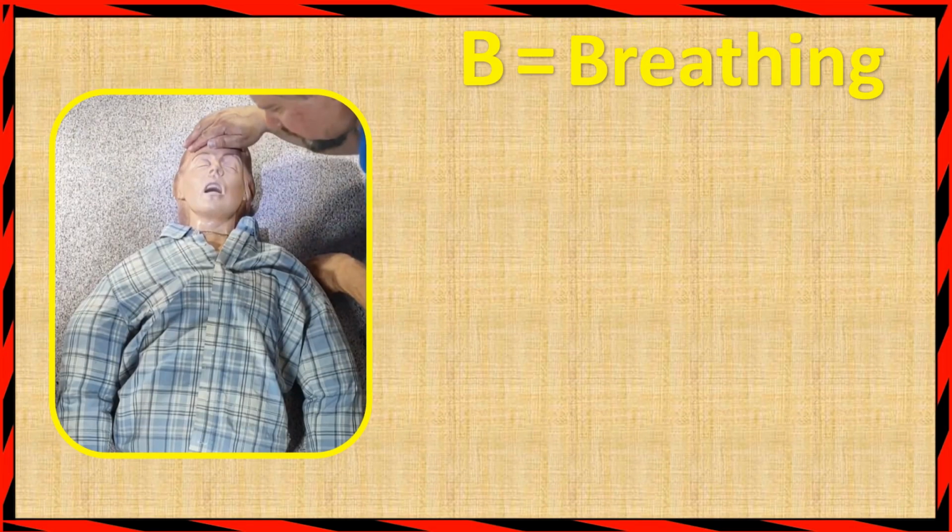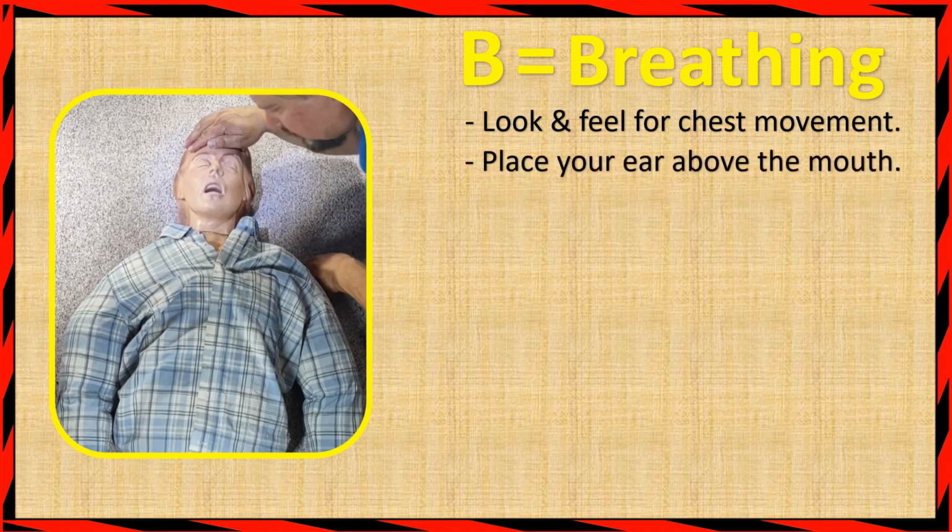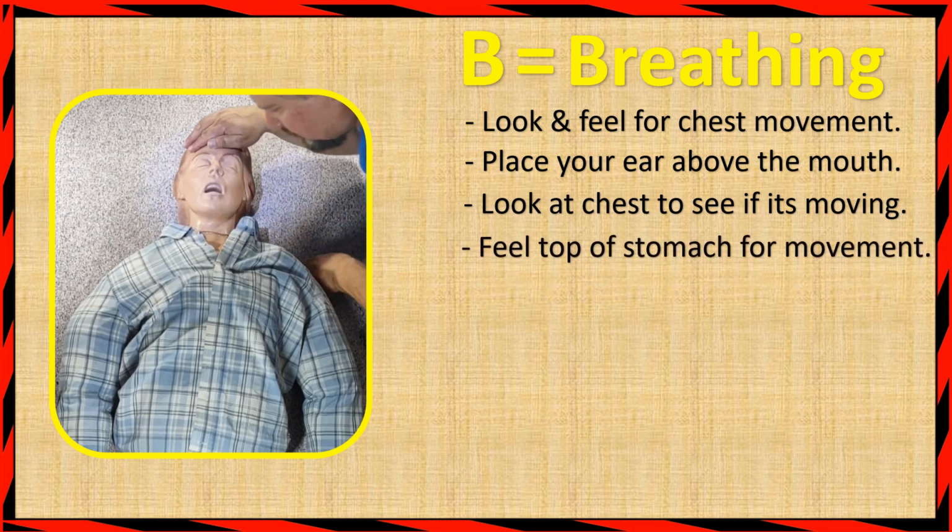B for breathing. Look and feel for chest movement. Place your ear above the mouth. Look at the chest to see if it's moving. Feel the top of the stomach for movement. This should only take about 10 seconds.